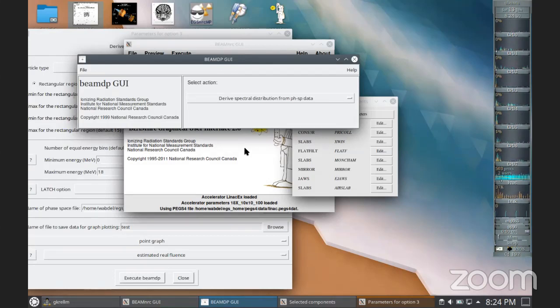Okay. You actually take advantage of this when you run the dose calculation, for example. Suppose you have a 40 million particle phase space file. But usually to get good statistics, you would need 1 billion. So what will happen is after it uses all the 40 million particles in your phase space file, there are techniques that say now we have to reuse the particles. Suppose the particle was at 1 and 5 centimeter, because you can tell it it's symmetrical. You have to be careful because sometimes you don't want this symmetry. If you have a wedge field, for example, you don't want that.